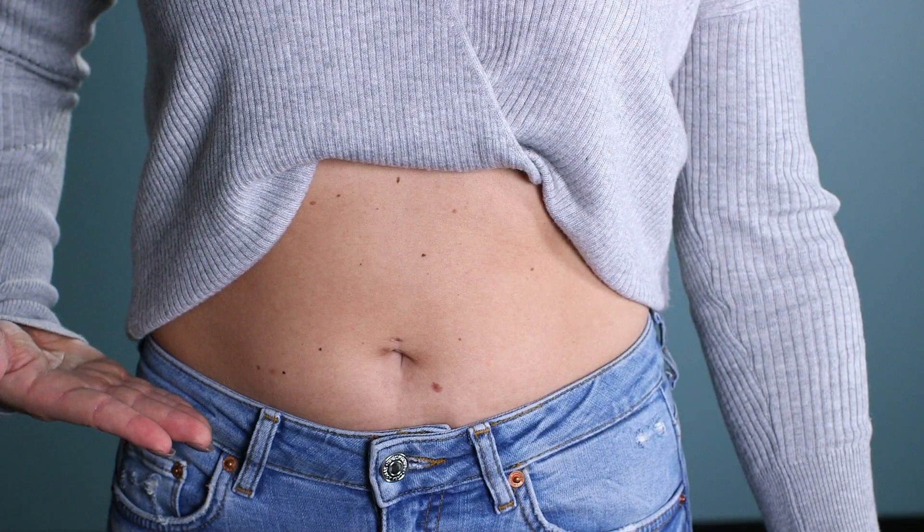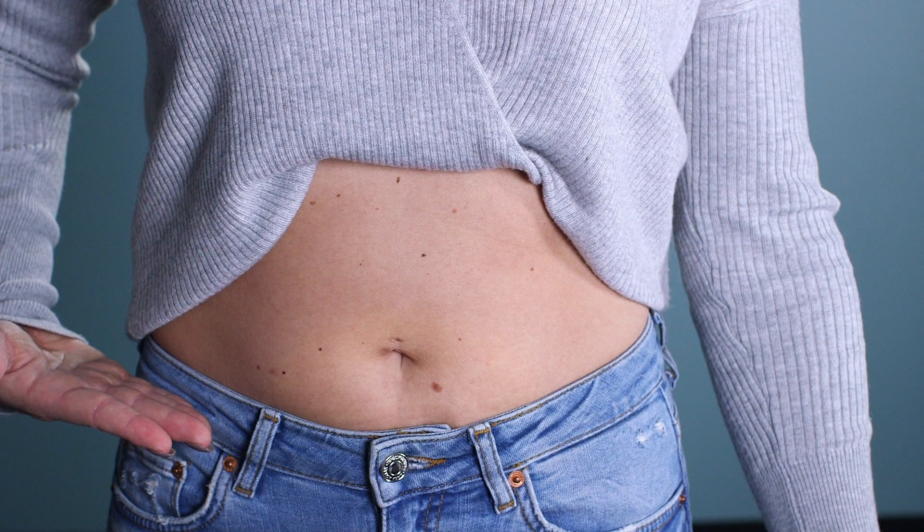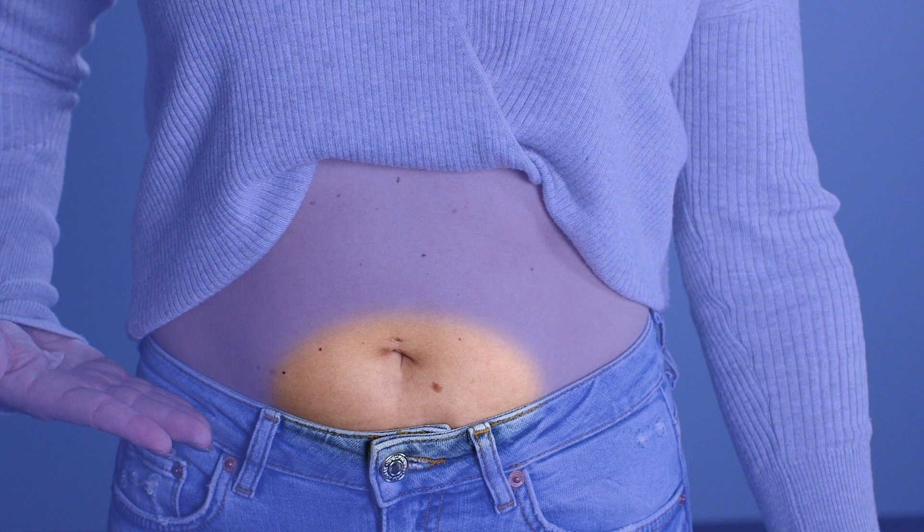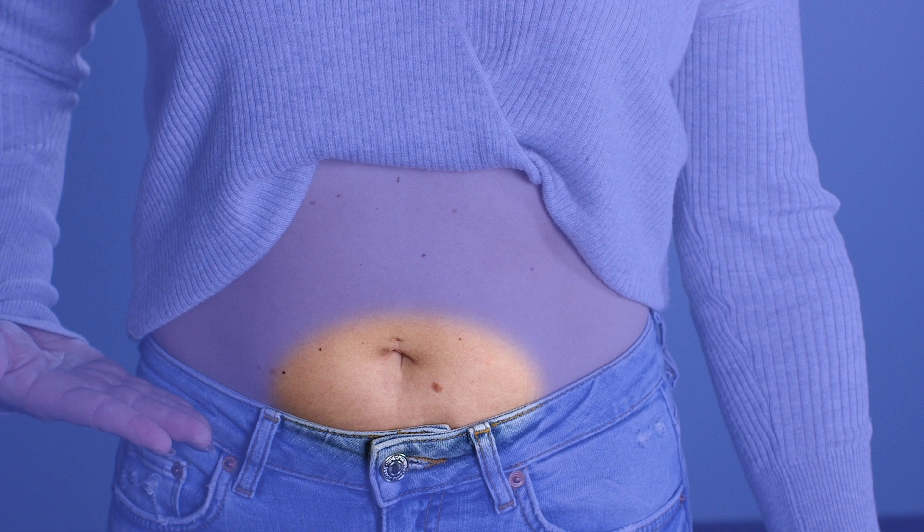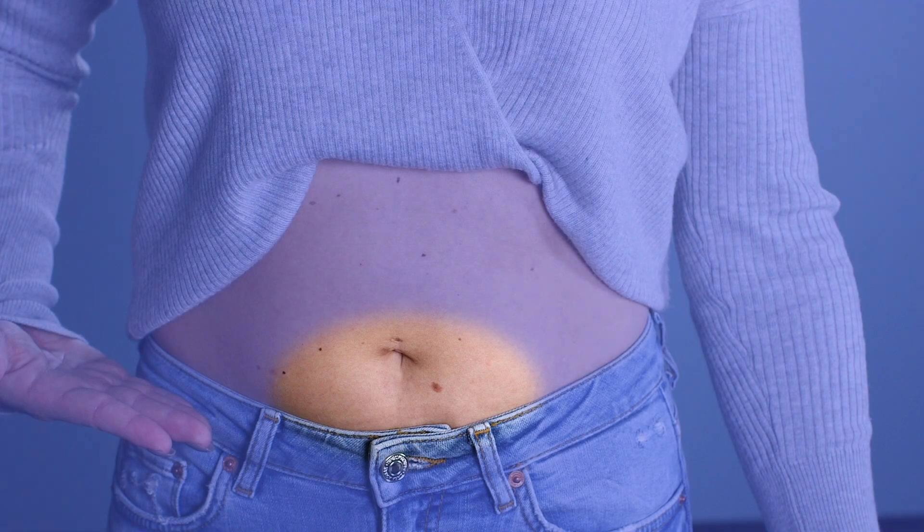For subcutaneous injections, make sure you wash your hands with soap and water. The most common site is the abdomen, using the left, right, or below the belly button, staying approximately 1 to 2 inches away from the belly button. You can also use the back part of the upper arm or the outer aspect of the upper thigh.